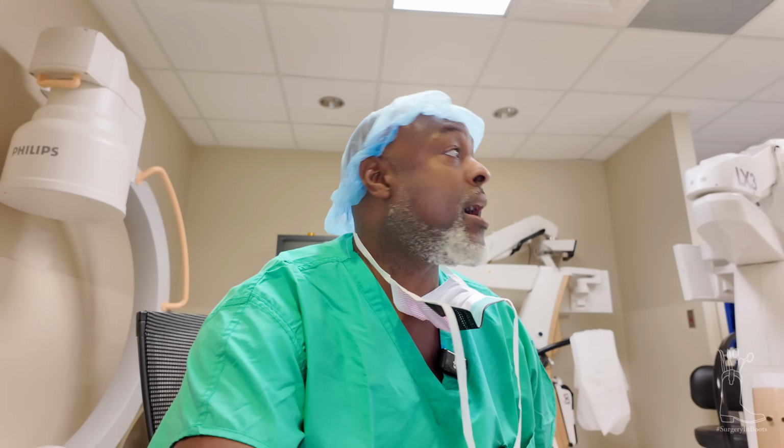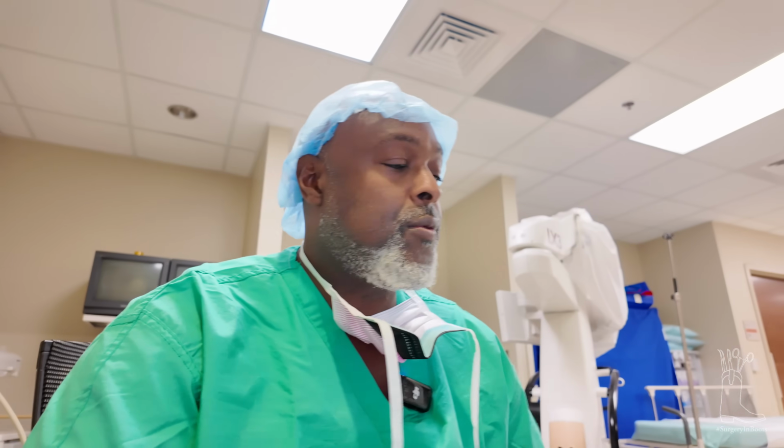Bye. So that's how you excise an aneurysm. So more than likely, it was probably a radial artery aneurysm. You have a radial and an ulnar artery. The radial usually is the main supply. Ulnar is the backup. But in him, it was kind of cool when you pressed on the ulnar artery, you wouldn't get a pulse at that pedicle that we ligated.